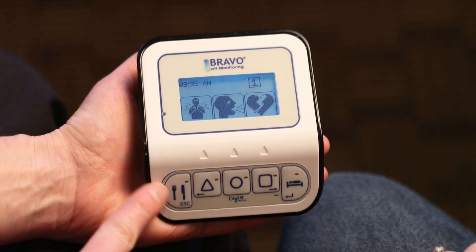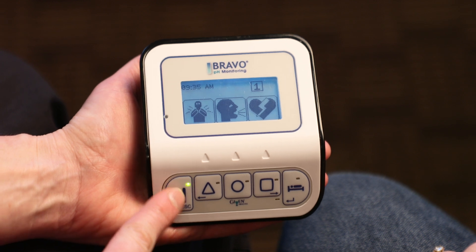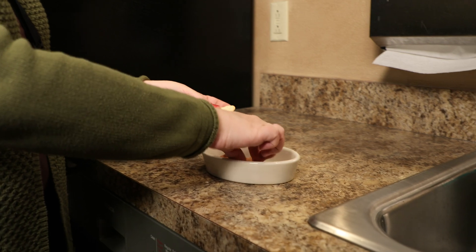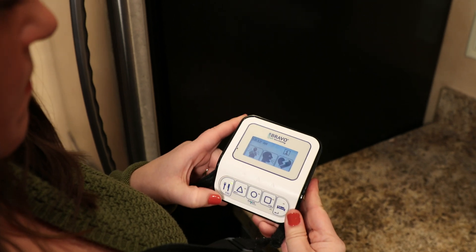The first button on the left is for meals. Press this button when you start a meal. The button should blink throughout the entire duration of your meal. Press the same button again when the meal is done and the receiver will stop blinking.